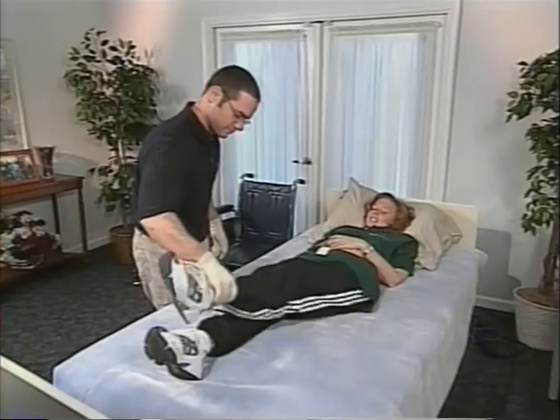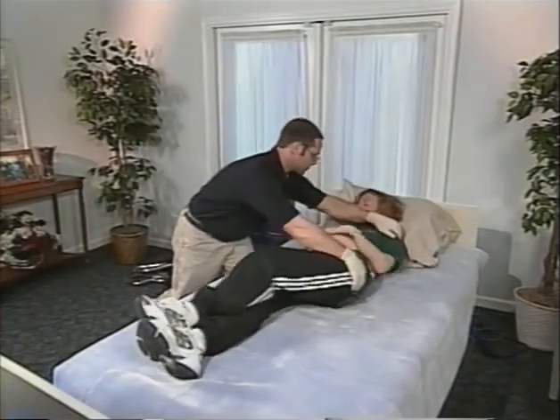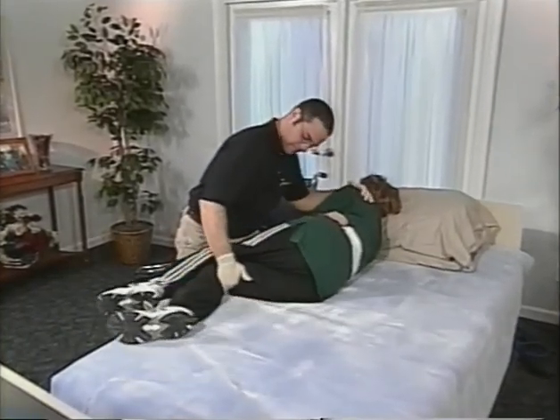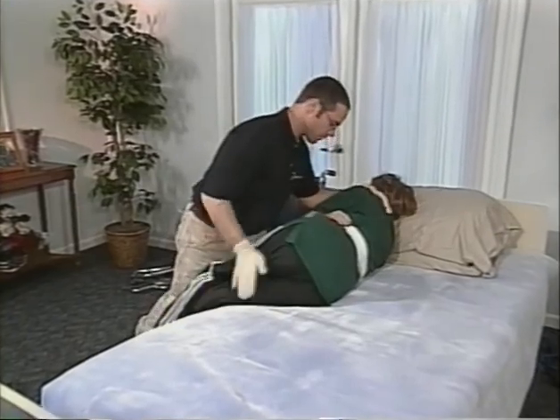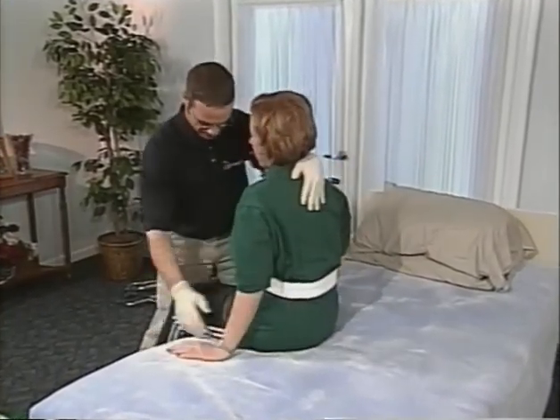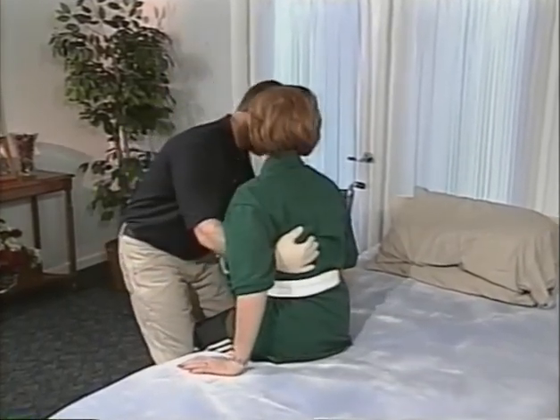Standing pivot transfers work especially well with clients who can actively participate in the pushing part of the transfer. Repeat procedures for wheelchair preparation and client preparation as previously demonstrated. Once at the edge of the bed, assume the same body position as in the squat pivot transfer.